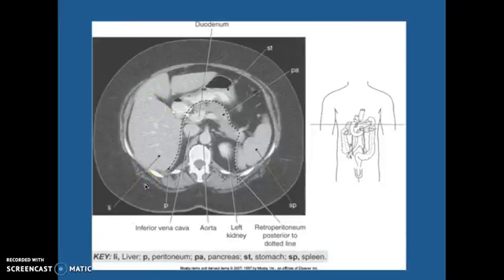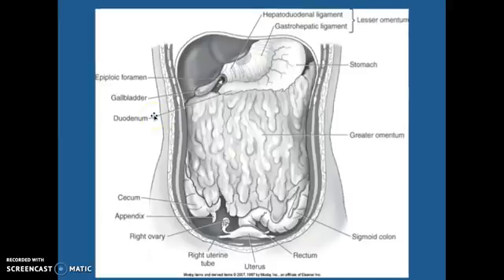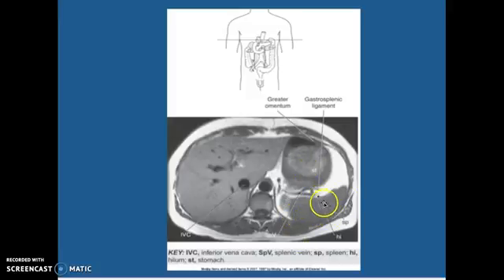Here is a CT post-contrast. Here's your line there for your peritoneum and your pancreas, stomach, spleen. There's the top of your kidney there and your inferior vena cava, and here is your liver. Looking here, we have your lesser omentum up top with your stomach and you have your greater omentum. This is your stomach and you can see they have food in their stomach. This is your spleen and they're calling this the hilum right there, and this is your splenic vein. Here's your aorta and there's your inferior vena cava.